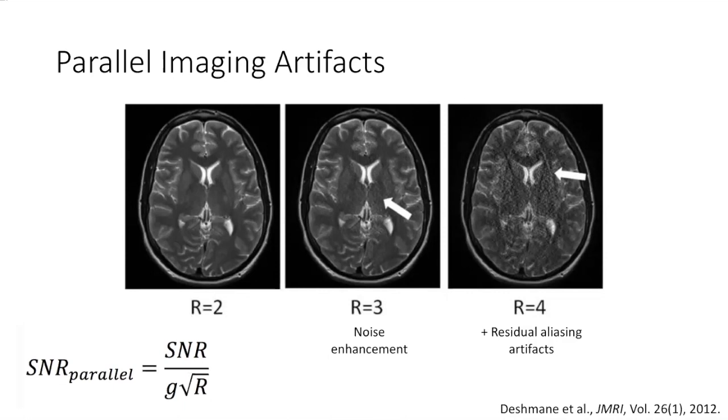So what happens if you have, for example, a coil that's centered around the edge, as you showed on the previous slide, you get a lot of unique information along the periphery and the edge of your brain, but each coil has the same exact information within the center.